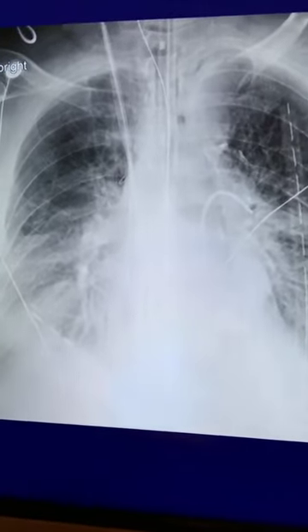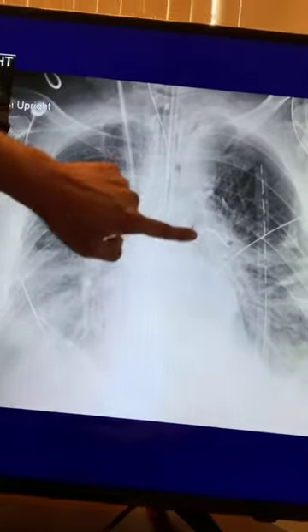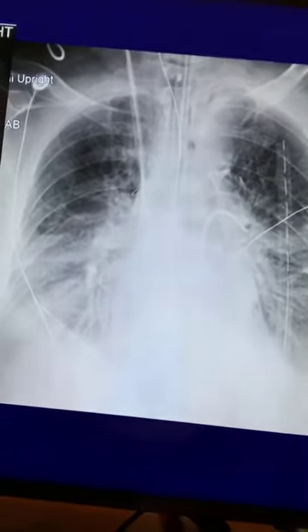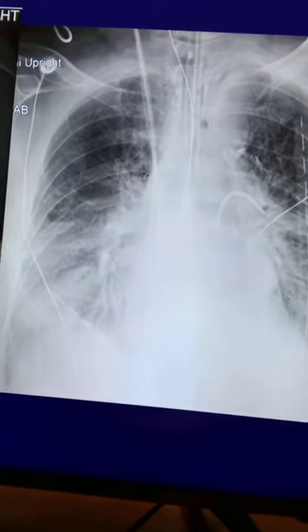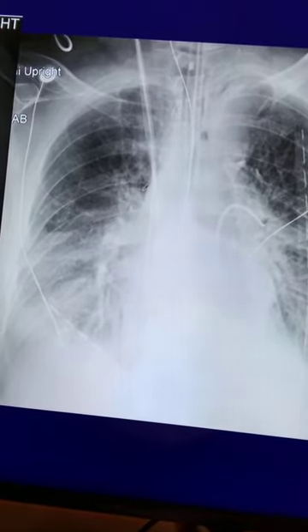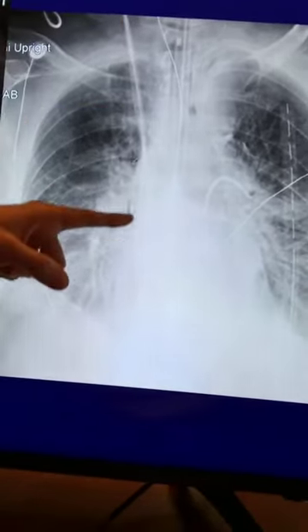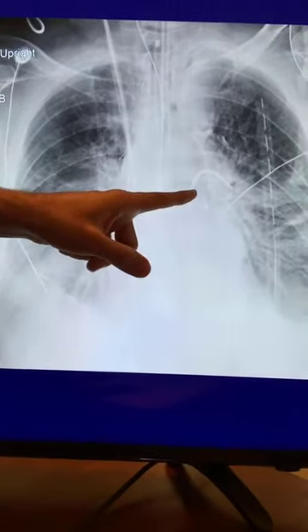All right. So this one is interesting because this one is all about lines and tubes. So you have to figure out, first things first, I can't even see it on my screen. What is this line right here? What is that? Anybody? So just describe it. Where's the axis? Is it coming from below or is it coming from above? Yeah, somebody just mentioned Swan. So for anybody who's not familiar, it's a Swan-Ganz catheter, all right? The cardiologists use this, intensivists use this, and basically it's going from the IJ, into the heart, out the main pulmonary artery, and look, it's curving down into the pulmonary artery right here. So that's a Swan-Ganz.